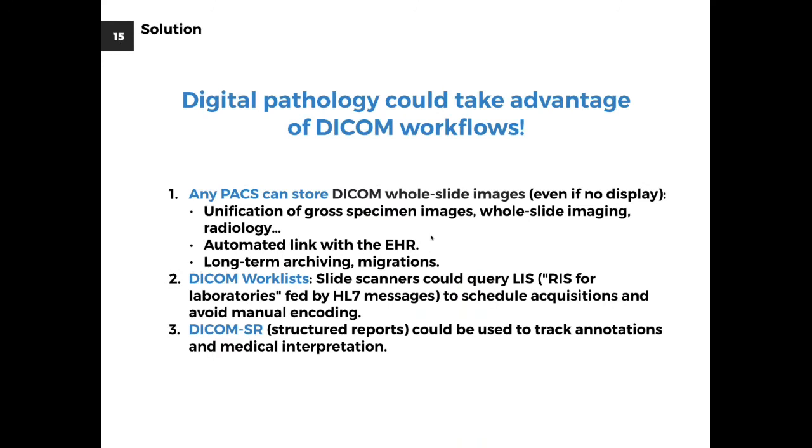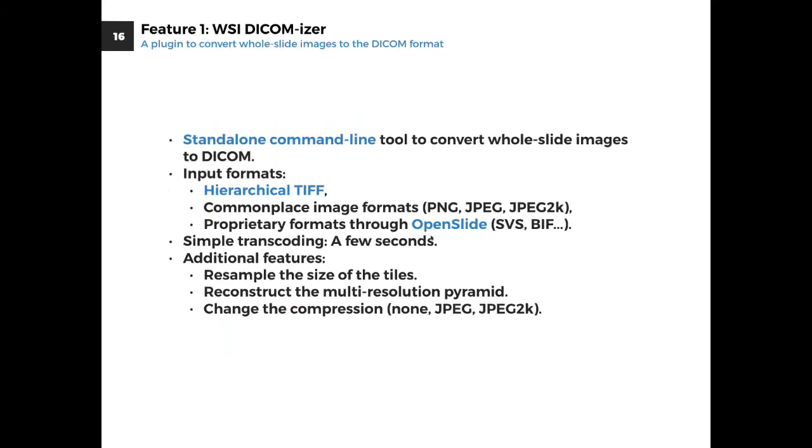So the solution could well lie in DICOMizing those images, which comes with a few challenges, but the advantage of doing this is that any PACS can store this kind of files, and it can then be integrated in the workflows of the hospital through the DICOM worklist. So a RIS would then become a LIS, a laboratory information system, and the structured reports could be used in order to track the annotations and the interpretations.